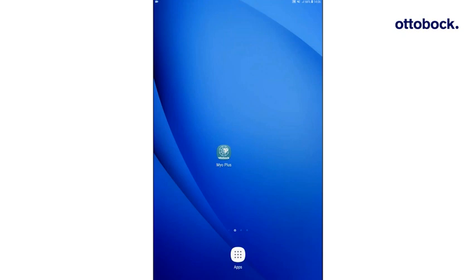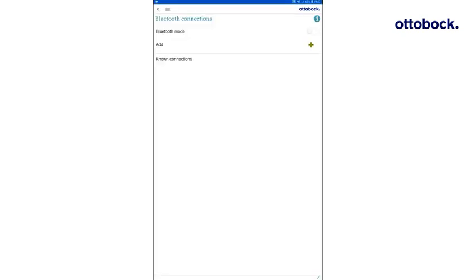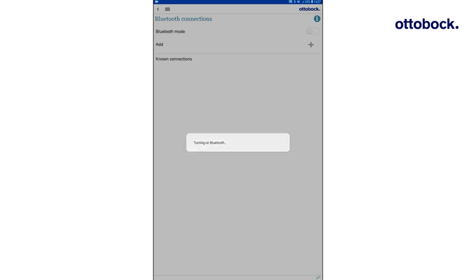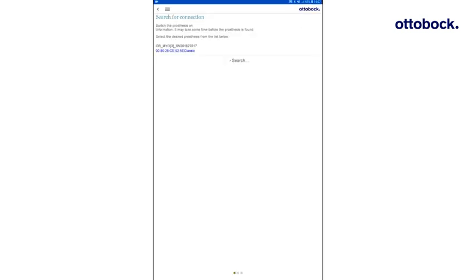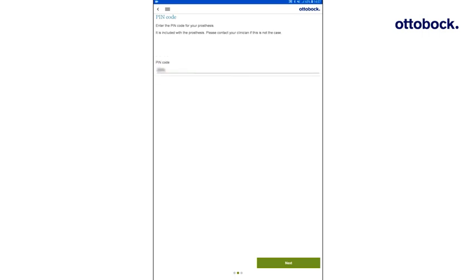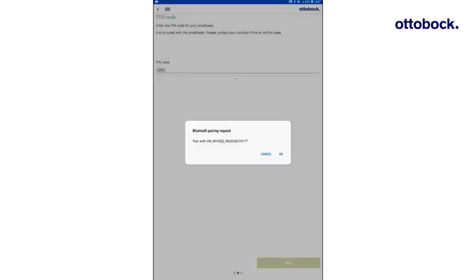Start the Myo Plus app by clicking the Myo Plus icon. Add a new Bluetooth connection by tapping on the Plus icon. In case Bluetooth is not activated on your device, confirm the request dialog with Allow. Select the Myo Cuff by tapping on its serial number which is printed on the PIN card that is delivered with the Myo Cuff. On the card, you will also find the PIN code that must be entered in the next step. Press Next. And if a Bluetooth pairing request pops up, confirm with OK.